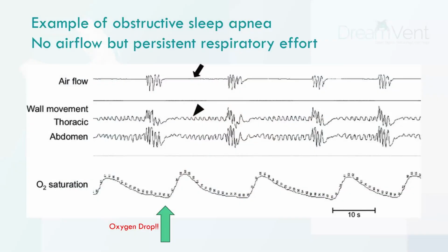So this is what we see when we do a sleep study. You have to do a test for these individuals. Briefly, I would like to point out what we are interested in seeing. Airflow means the airway; we measure it by a pressure transducer outside the nose. So this is airflow. Airflow means the person is breathing, air is coming in and out of your nostril. This is effort. We measure thoracic movement and abdominal movement, the chest movement and abdominal movement. These are the movements you can record, and we are recording the oxygen here.